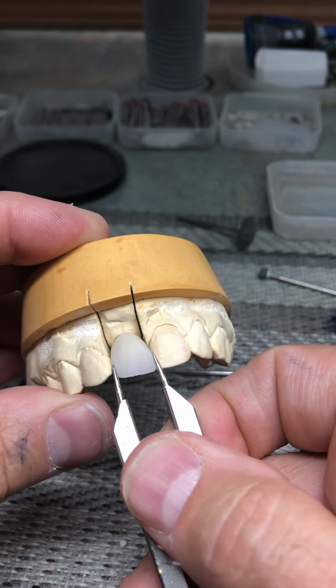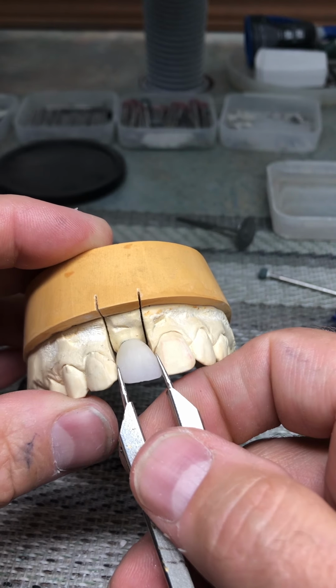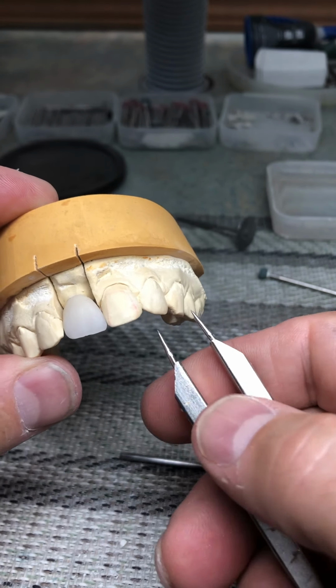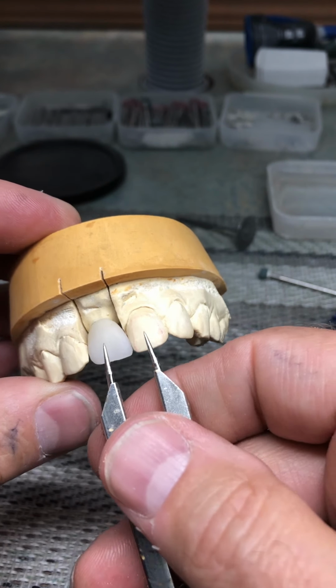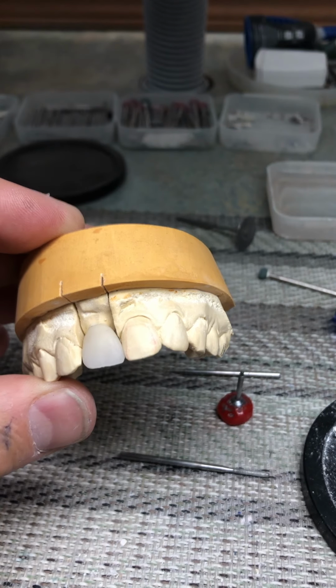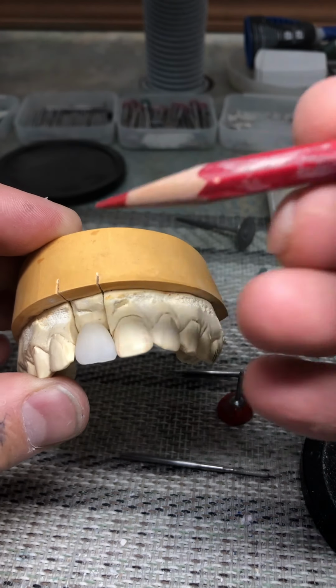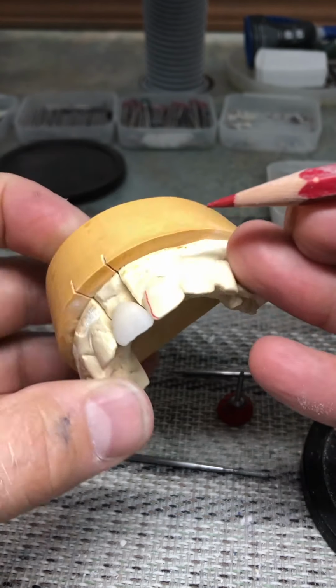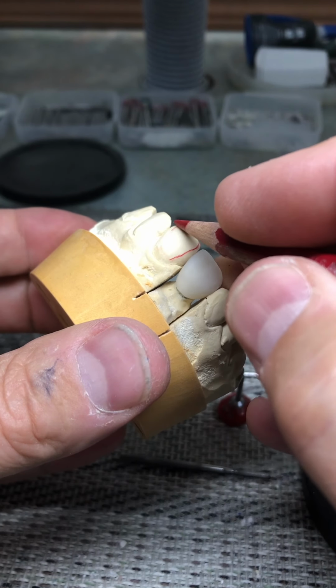The actual width is obviously going to fill the space. We're not leaving a diastema. So we have to utilize the line angles to make the apparent width of number 8 look like the apparent width of number 9. So we'll use our pencil to define the line angles and the heights of contour accordingly.